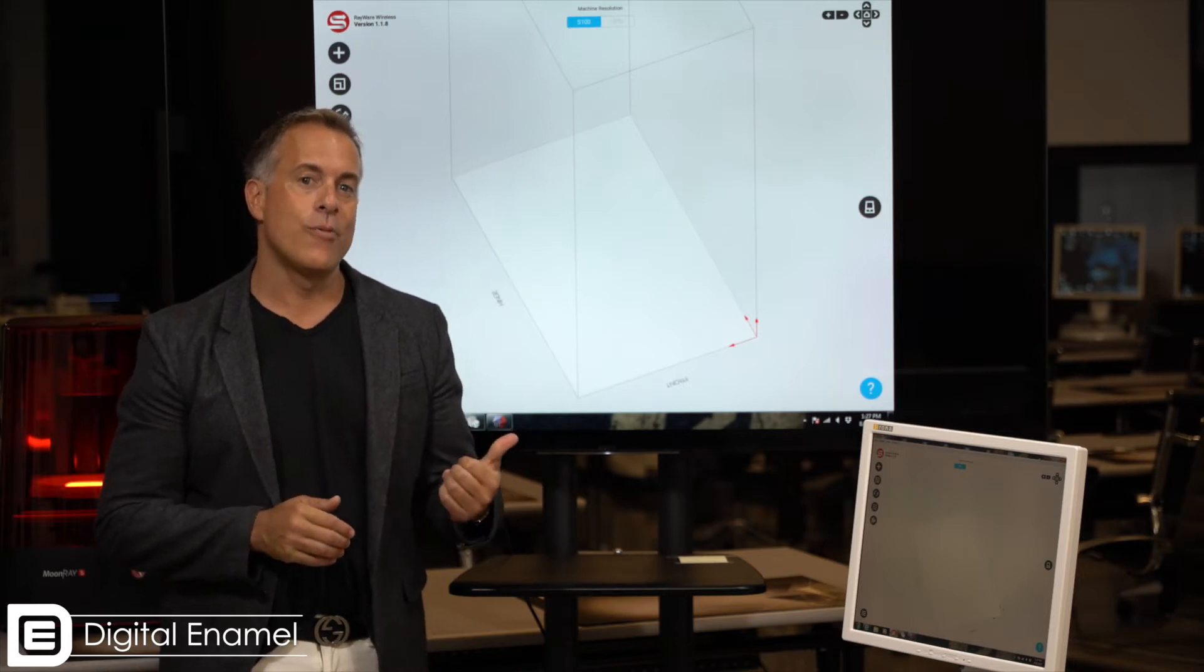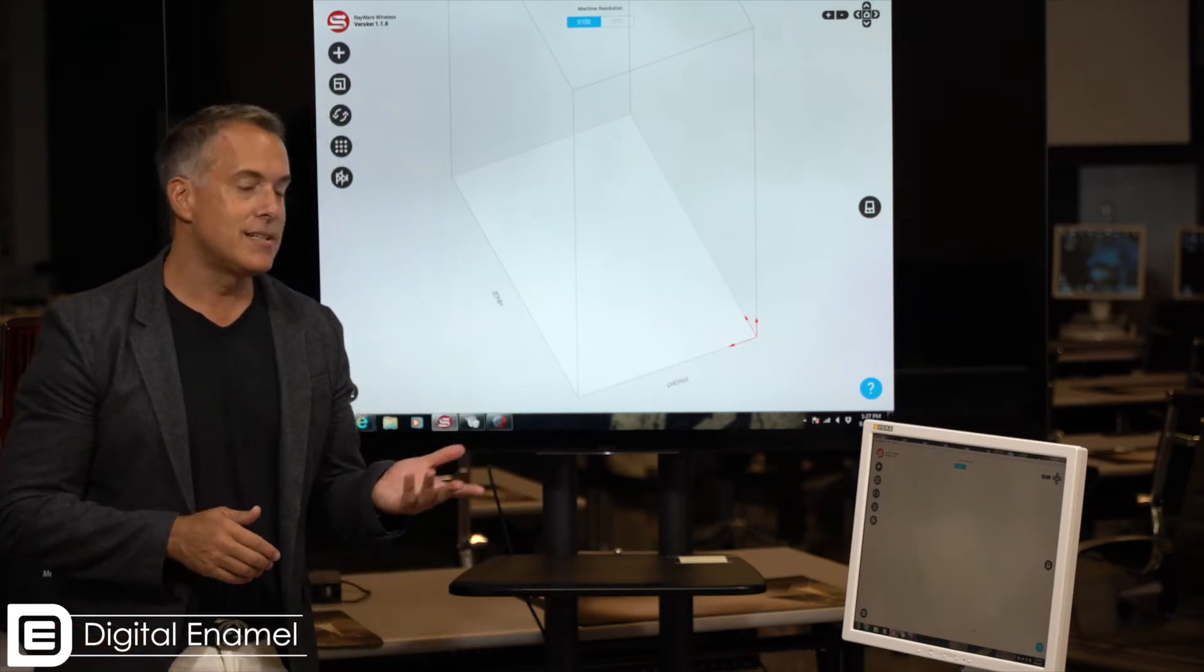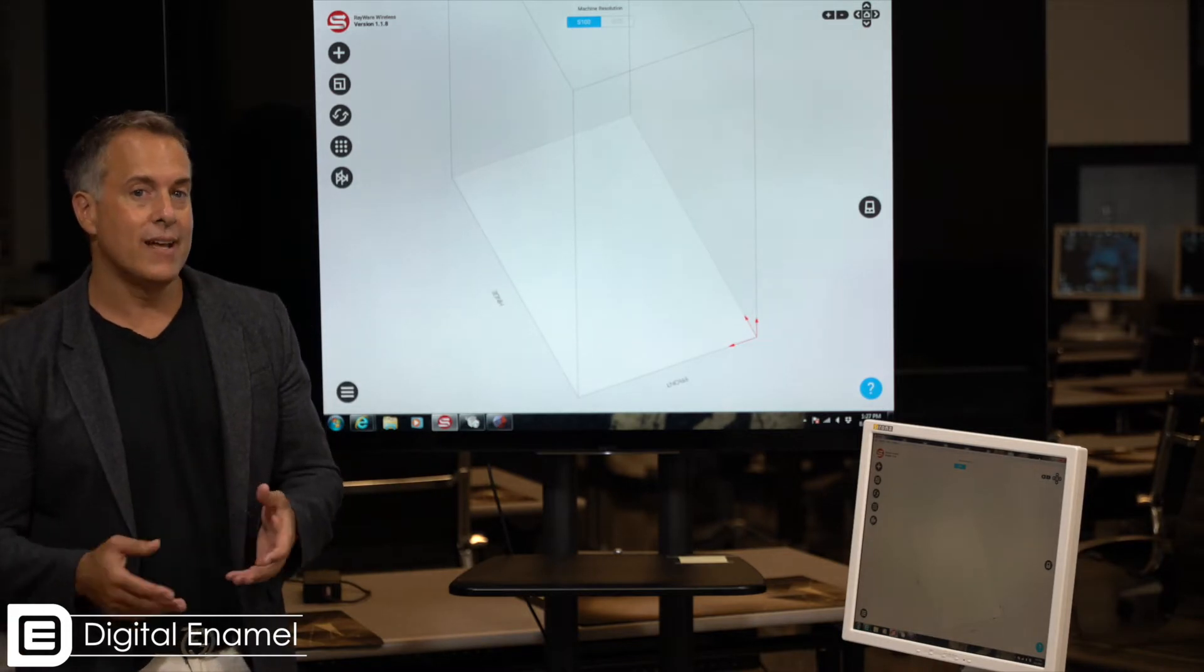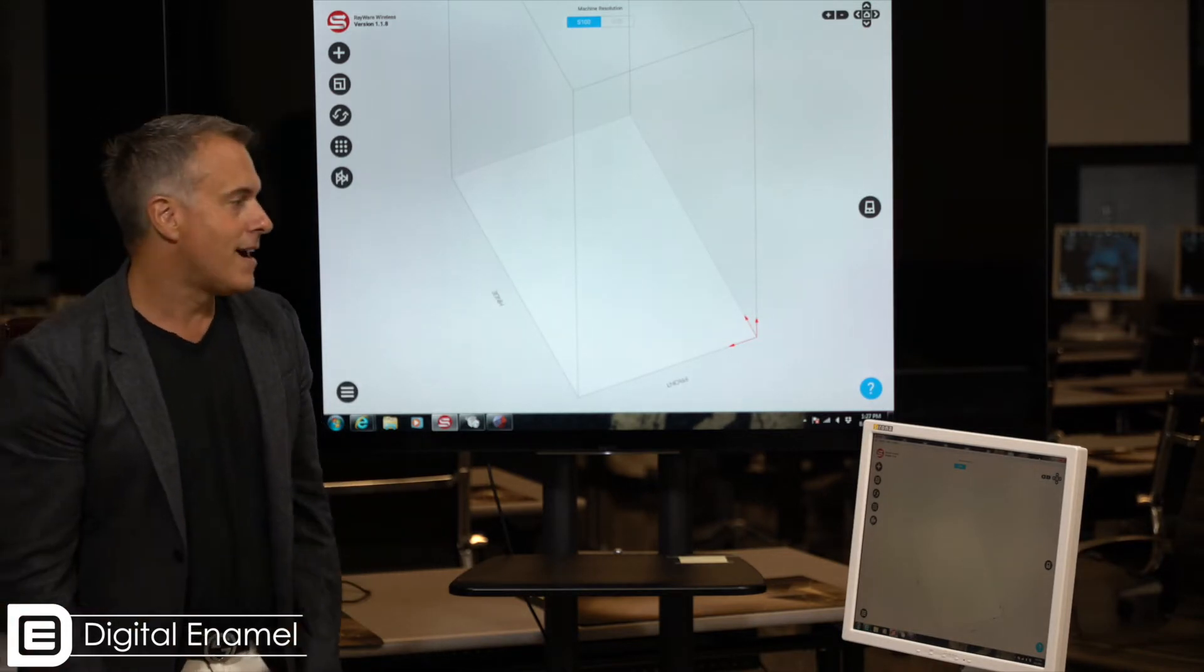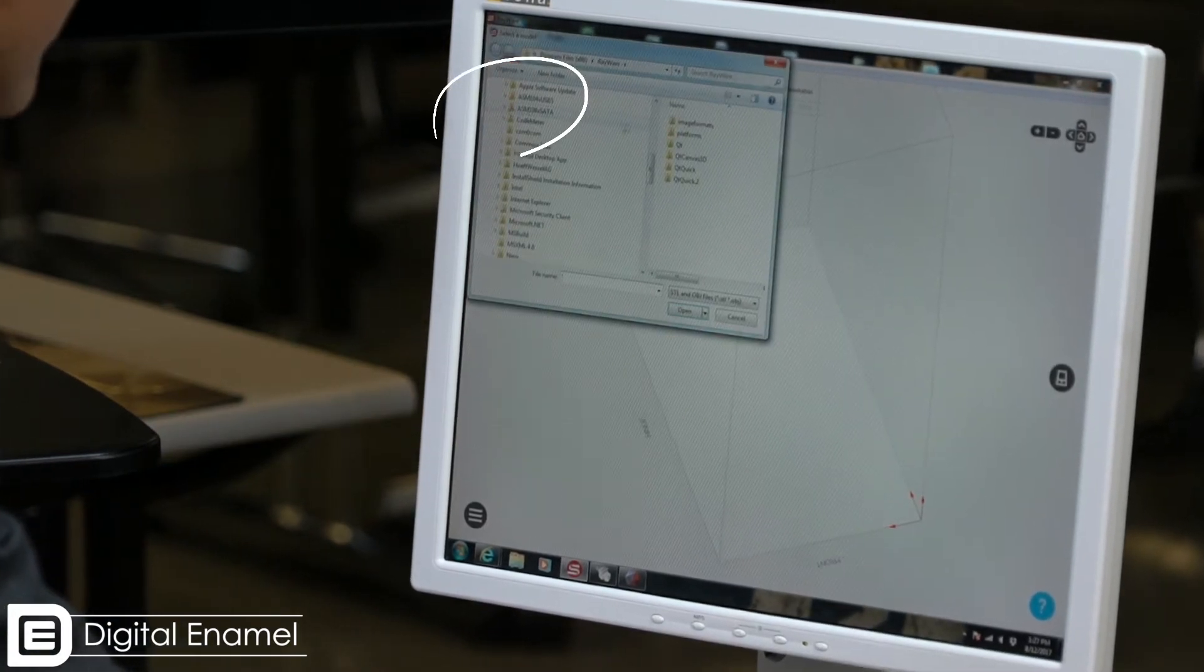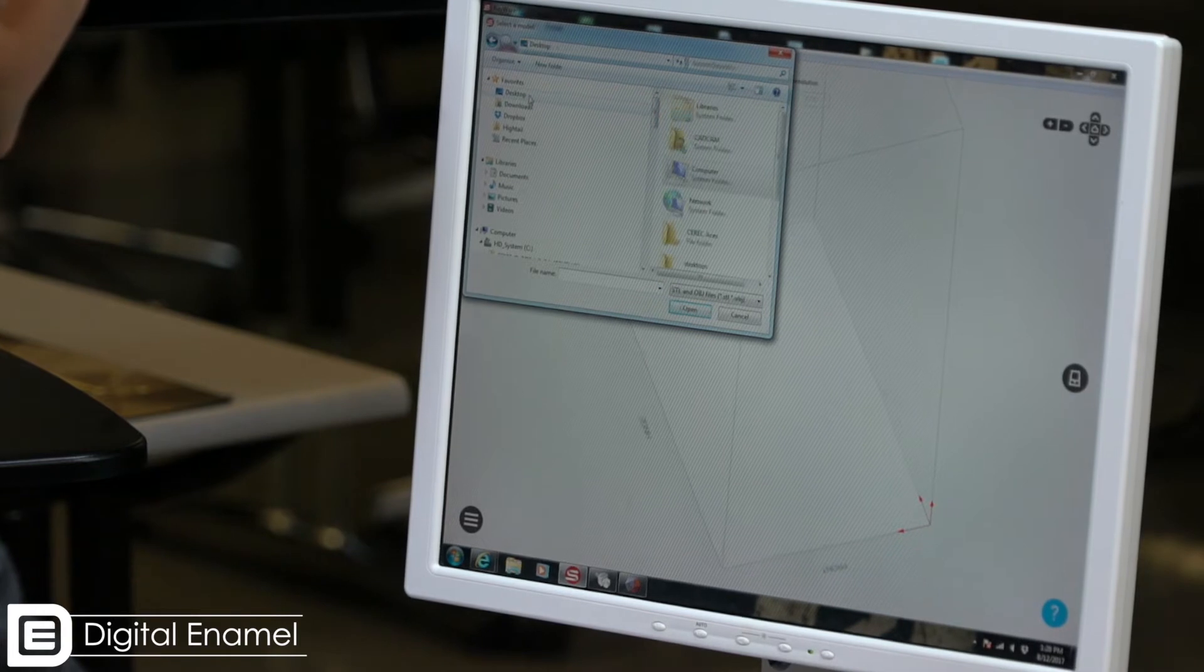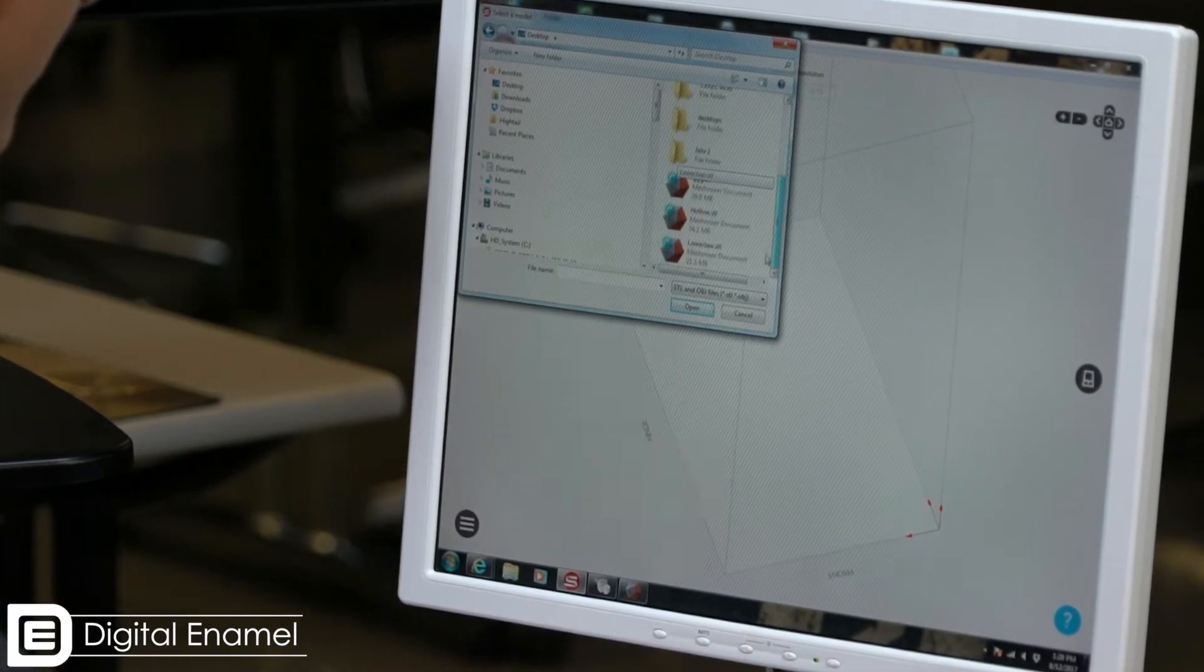All you really need to do is import your model by either dragging it or importing it using the file import function. There's a little plus sign right here on the screen and I'm going to go to my desktop and select my file.